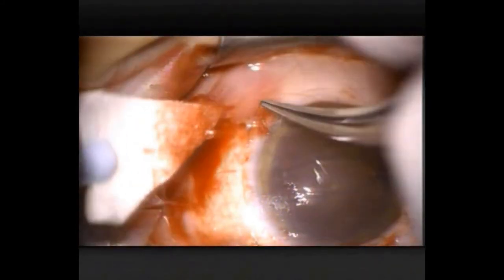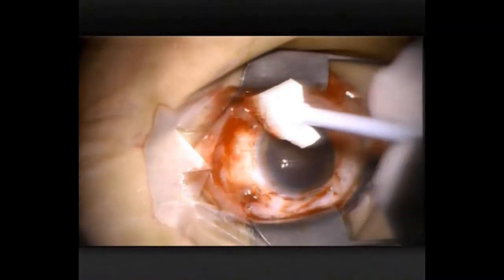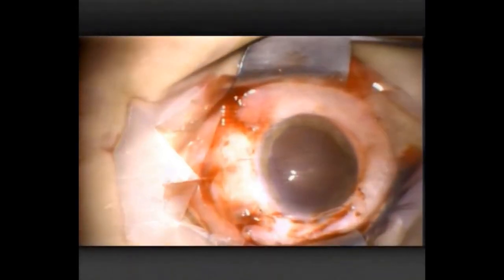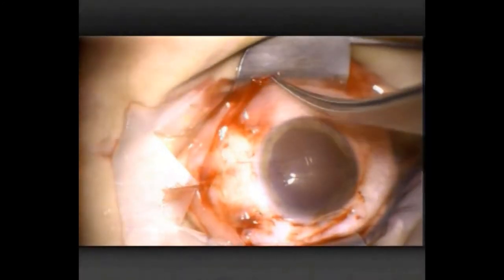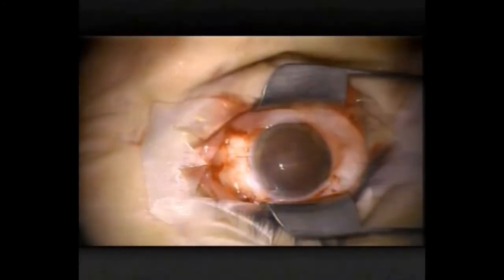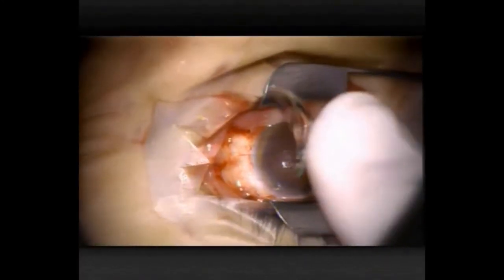Post-operatively — or intraoperatively — we use some topical non-steroidal eye drops. And I always leave a bandaged soft contact lens. In the last 20 years I've had, I think, one phone call from a patient or a family member of a patient who's got a very painful eye after pterygium surgery. So it helps both the patient and me to sleep better to leave them with a bandaged contact lens. I highly recommend that to you.